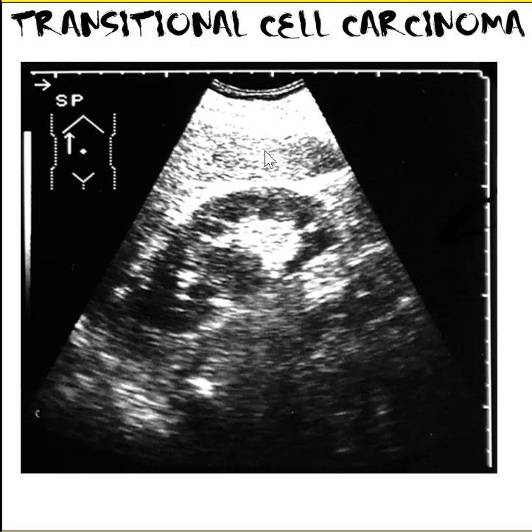So here are some examples of transitional cell carcinoma. We have the kidney here, so we have the cortex out here, and what we can see in the center is a hypoechoic structure in the pelvis of the kidney. So remember, renal cell usually comes from the cortex. Transitional cell is going to be found in the pelvis.